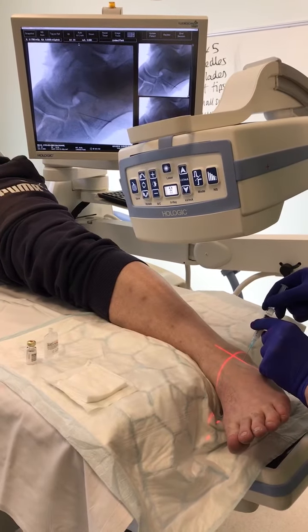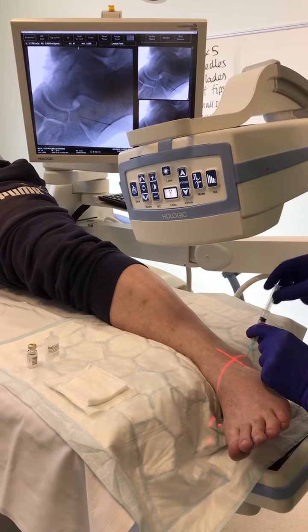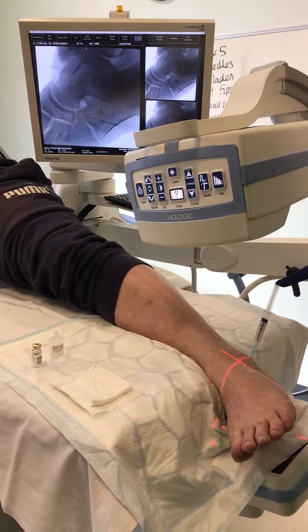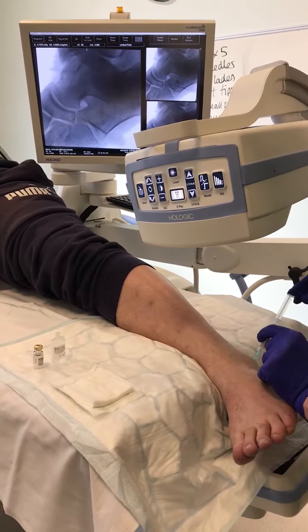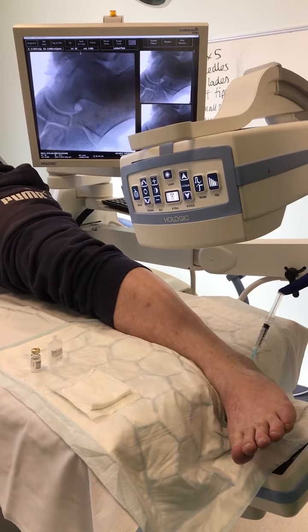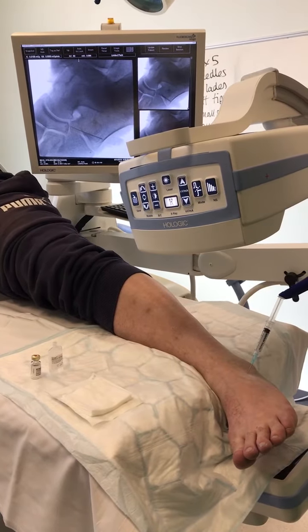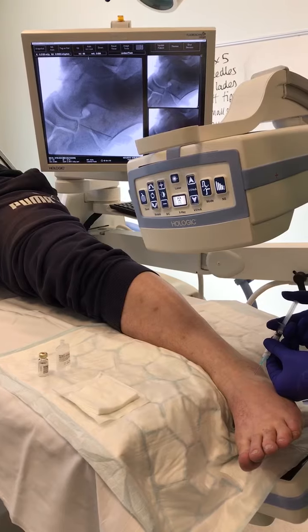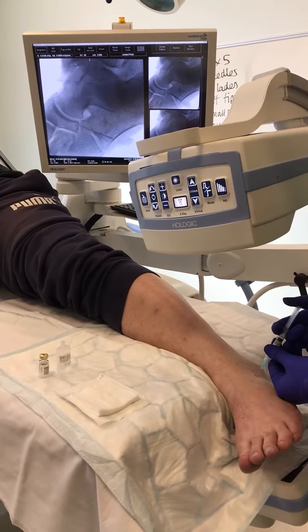So I think I'm probably going to need to come out and just come across a little bit. Three, two, one, scratch again. Can you see the needle tipping right on the spot there? So now we can actually inject it.